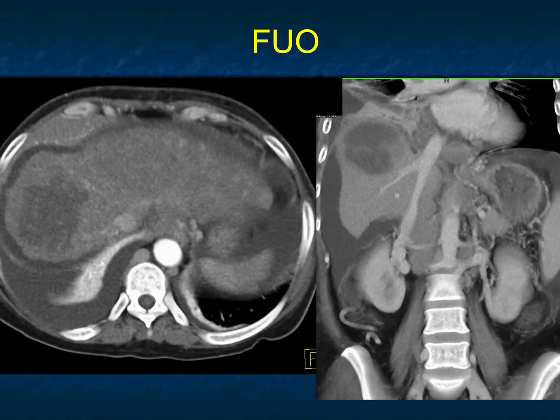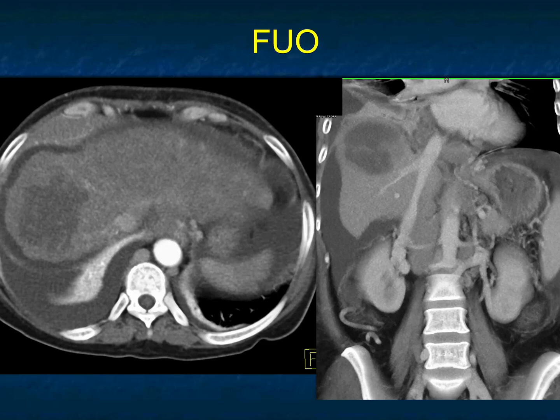This patient has a fever. You can see a low-density cystic lesion at the dome of the liver. There's ascites present and maybe a little bit of adenopathy. You can go through the differential diagnosis of malignancies, but when you see a cystic liver lesion and the patient is febrile, you always have to think about an abscess. Maybe the patient had diverticulitis, appendicitis, is immunosuppressed, or had recent surgery. You don't want to miss an abscess — abscesses are great mimickers of primary hepatic tumors.